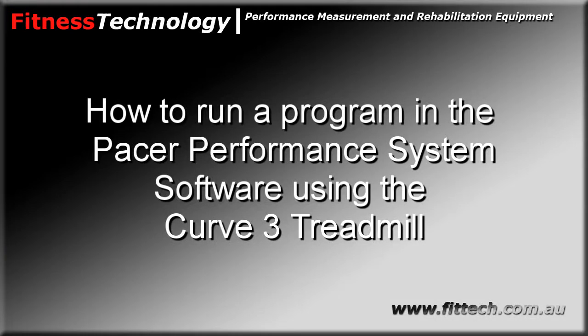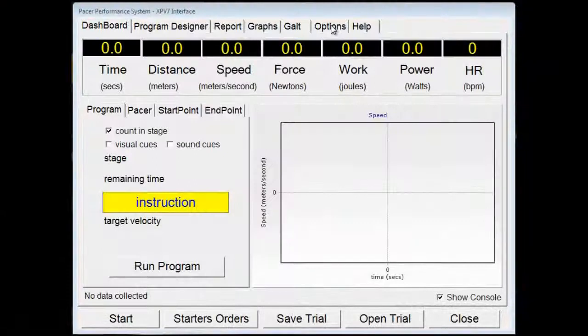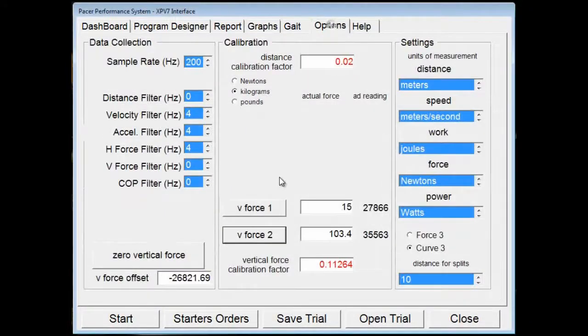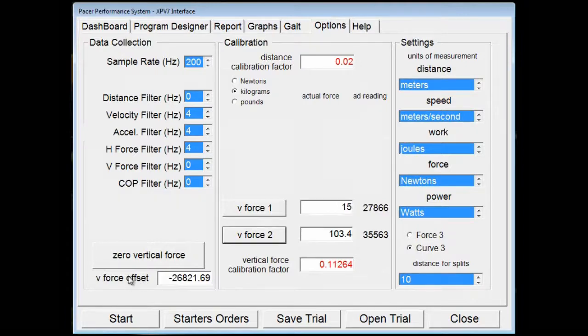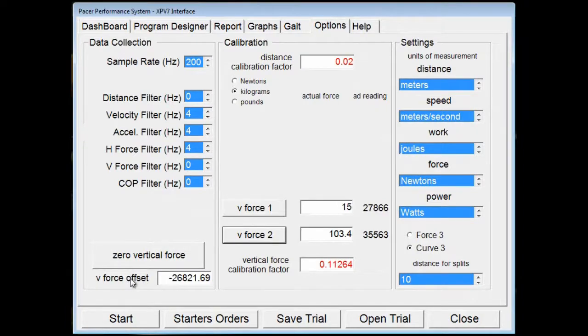I'm now going to go through the process for running a program file within the PASA software for the Curve 3. Start by going to Options and zeroing the vertical force with no mass on the deck of the treadmill. To do this, simply click on the Zero Vertical Force button as shown here.